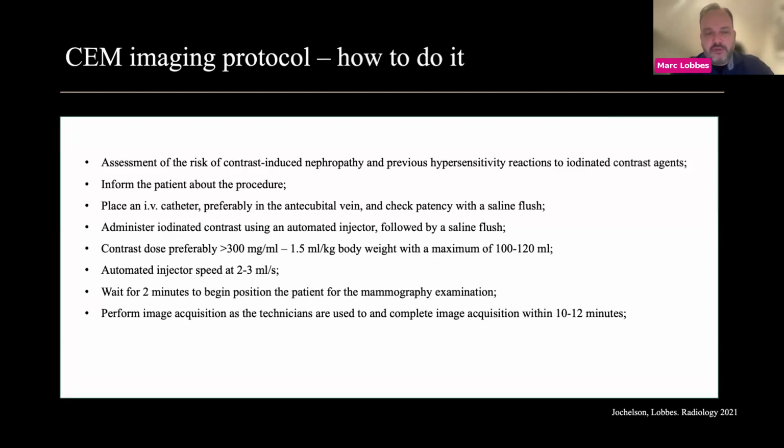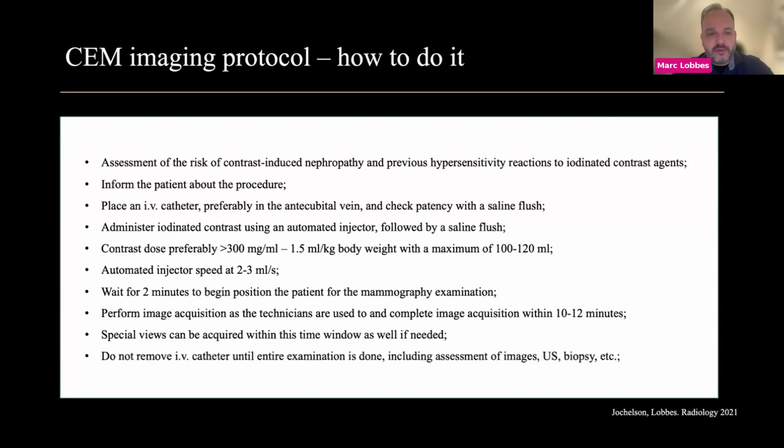But if you have a 2 minute delay before you start and you have experienced technicians, it's very easy to complete the examination in 6 to 8 minutes. And if you also count in the administration of contrast and the placement of an IV catheter, the whole examination is up to 15 to 20 minutes in total when you have an experienced staff. Special views can easily be acquired within that time frame as well.